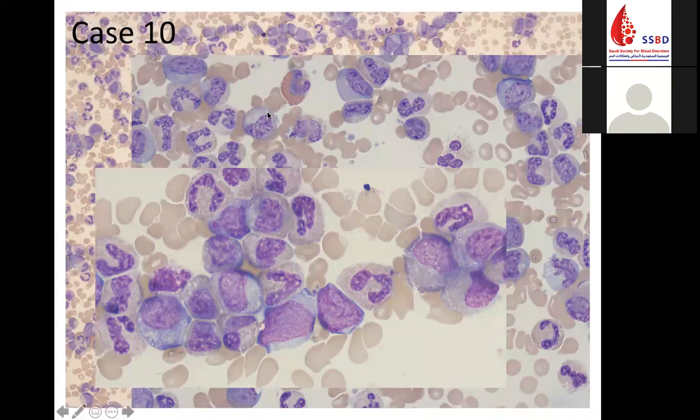So if you think that this is a chronic disease, a case of MPN, myeloproliferative neoplasm, yes, I agree with you. Most of you mentioned that this could be a CML. What test will confirm your finding? For chronic myelogenous leukemia, Fatma said CML chronic phase. I agree with you. The picture is going with CML chronic phase. So what tests will confirm this assumption?